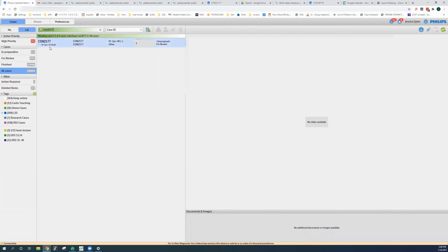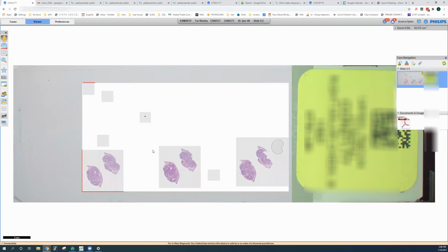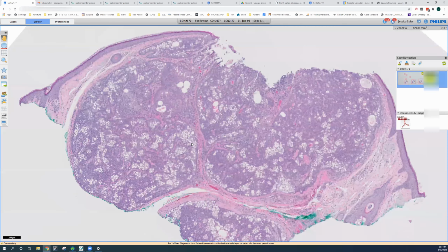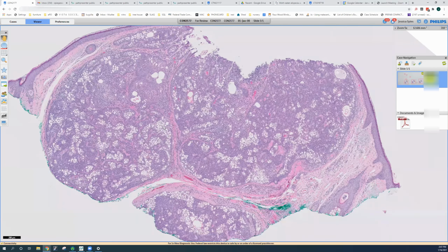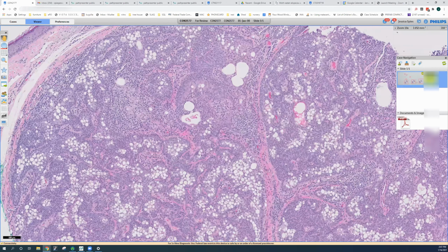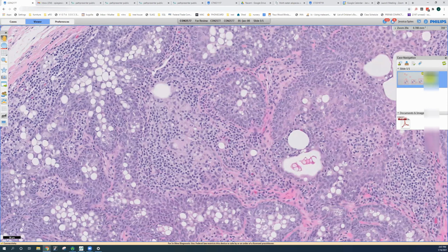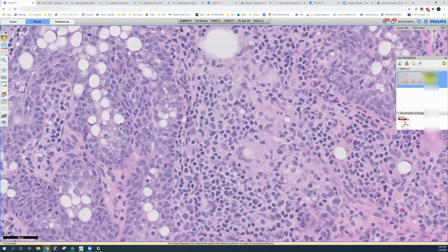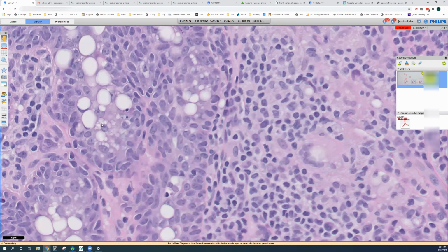Kind of related to a previous case we saw, similar but different. This is on the cheek of an older male patient, as I recall. And you can see there's a nodular infiltrate, multinodular, you could say, of blue cells and cells with this vacuolated cytoplasm. A lot of these vacuoles don't have the kind of fine vacuoles of sebocytes, but when you start looking around, these are sebocytes.